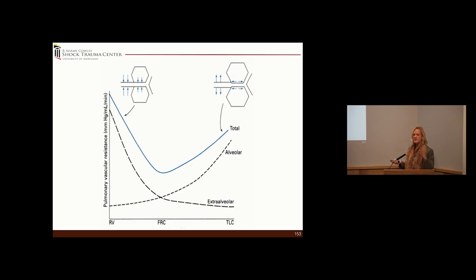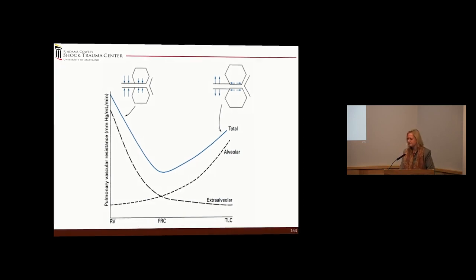But she was at residual lung volume. And Dr. Abashi likes to use the analogy of potassium. If I have a potassium that is normal, I'm not going to give 80 milliequivalents of potassium. But if my potassium is extremely low, I might need 80 milliequivalents to obtain a normal potassium.